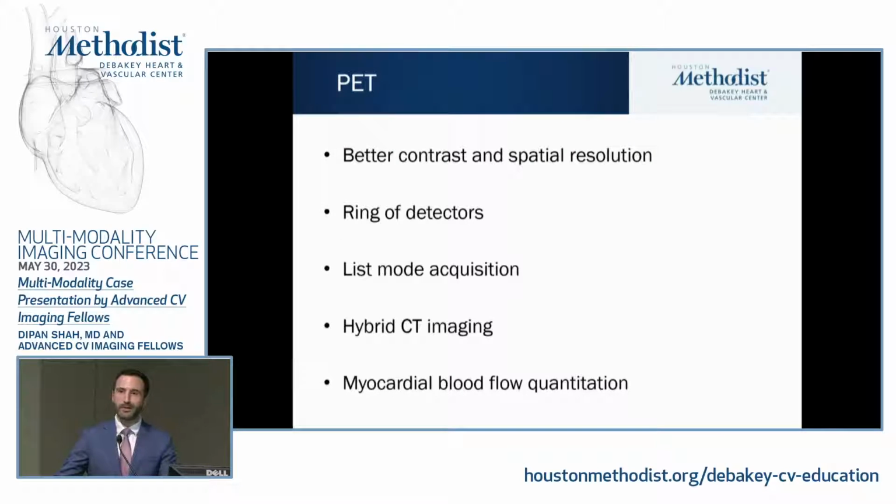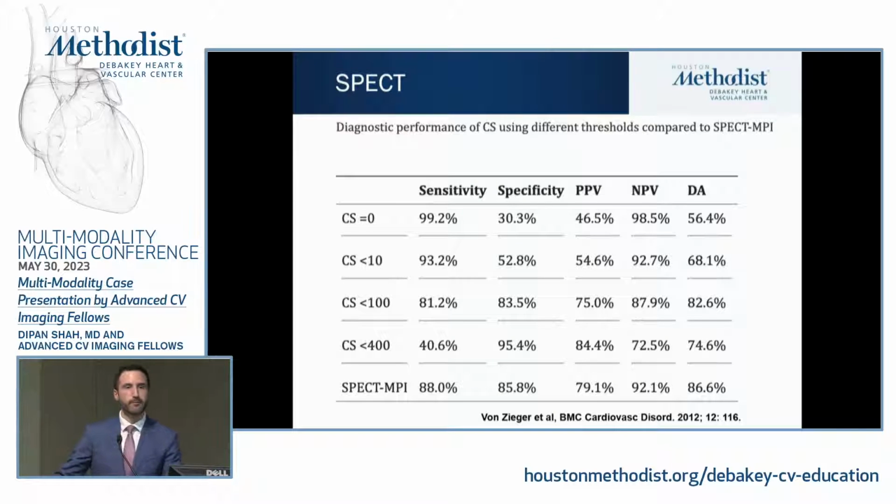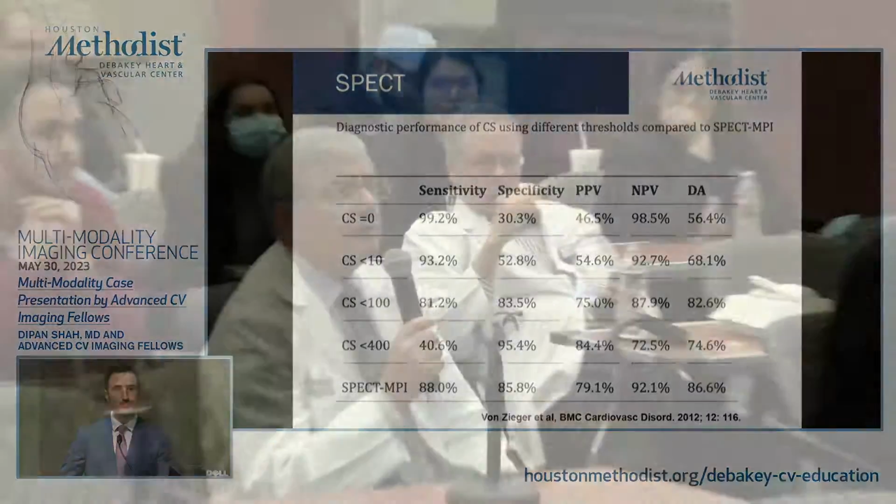Now moving on to PET, which is something I've been... Absolutely, yes, sir. Go back to that slide. Can you explain the calcium score less than 100, where sensitivity and specificity are much better?